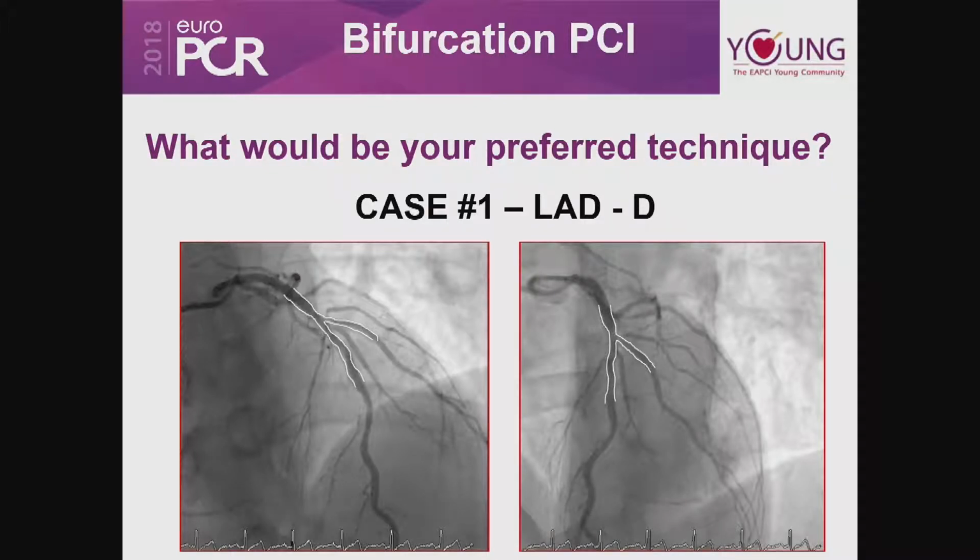Smaller, so it's a small angulation. And the plaque distribution we discussed when we were talking about Medina. To summarize, based on these two images, everyone was more or less confident to say something about the involvement of the three branches, proximal, distal, and side branch, about diameter, and about the angulation.